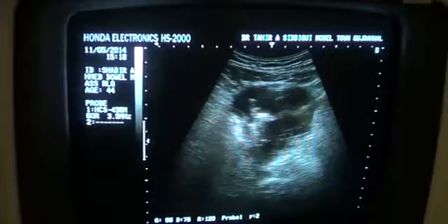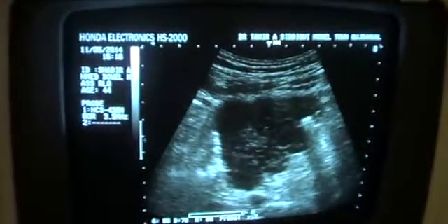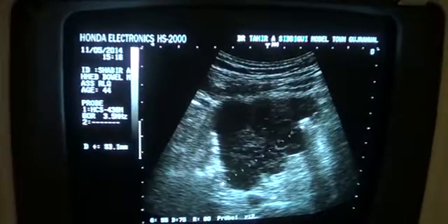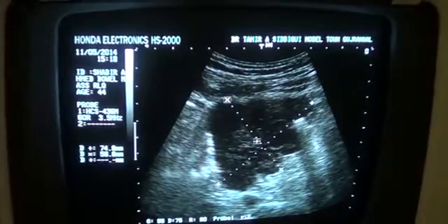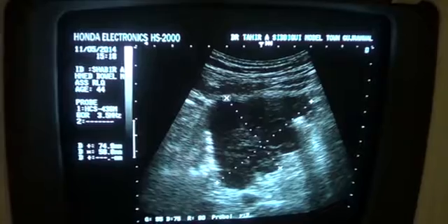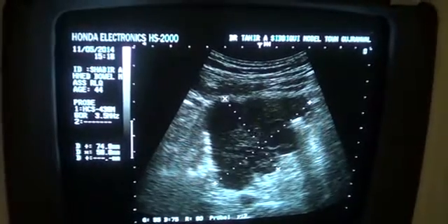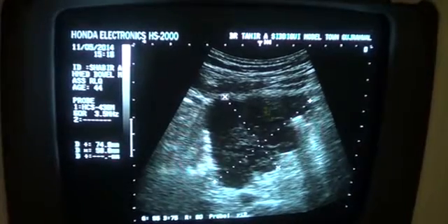And what you are seeing now in this view are low level echogenic areas. Why is it bowel related? You see, this is the air within this pocket, and this is appearing as a pocket of fluid with dependent region echoes, whereas we know that this is a bowel related mass.